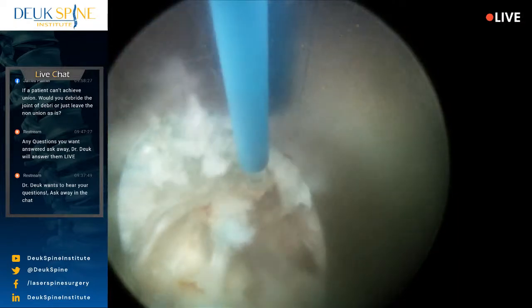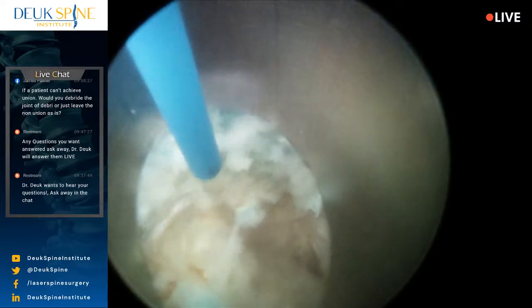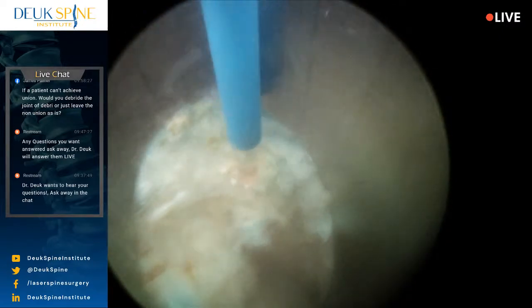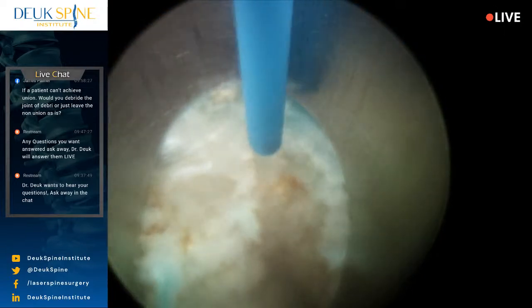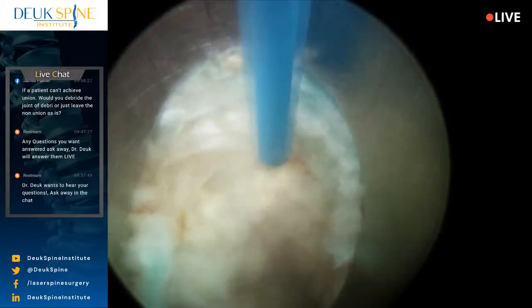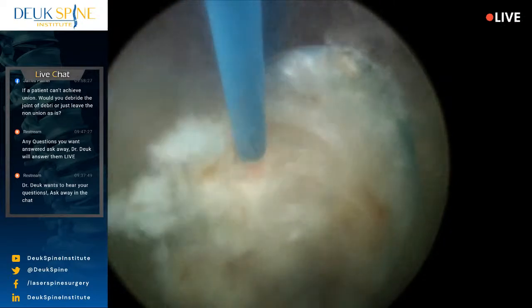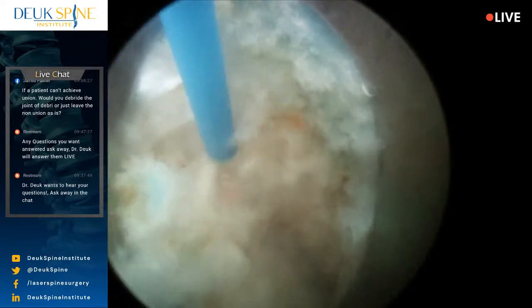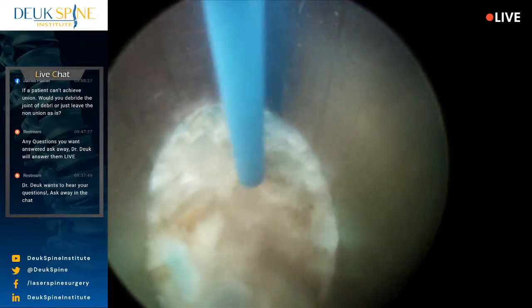degenerated nucleus pulposus, the stuff that's supposed to be in the middle of your disc, okay? So clearly the fact there's blue here interwoven between the annular fibers tells us that there's nuclear material from the herniation still in there. And you can see all the scar tissue, the golden whitey stuff down here. It's thick, not gelatinous, but thick. It's collagenous is the right word. And the golden color is calcium deposit.